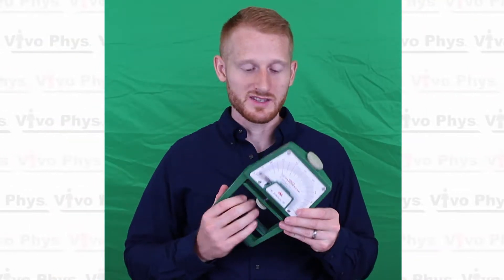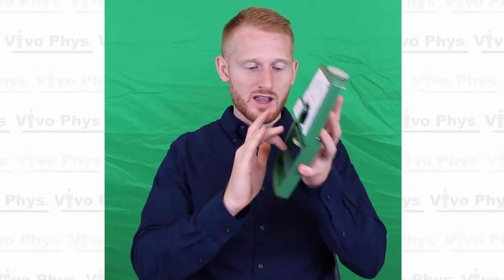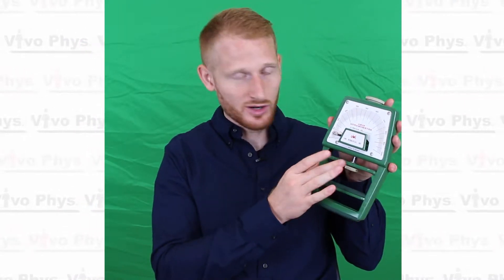For both of these devices there is an adjustment that needs to be done to adjust the grip size. You take the person's hand, put the middle finger at about a 90 degree angle — it should fit nicely onto the gripper part of the device with the rest of the other side of the gripper in the palm. If it does not, you can adjust it by turning the little knob, which will make it bigger or smaller.